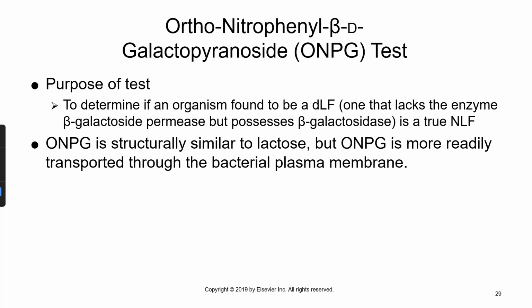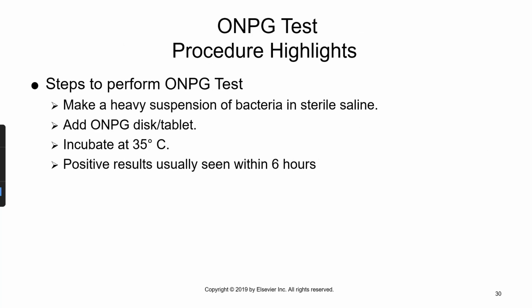ONPG is structurally similar to lactose, but ONPG is more readily transported through the bacterial plasma membrane. ONPG is ortho-nitrophenyl beta-D-galactopyranoside.